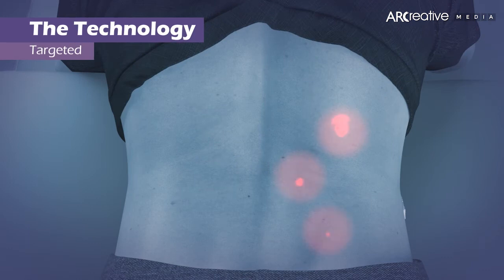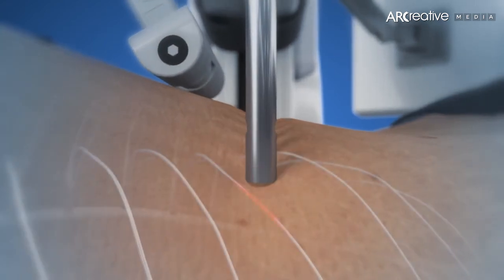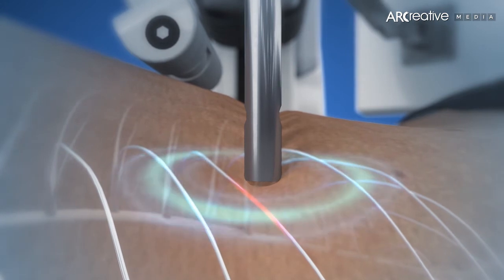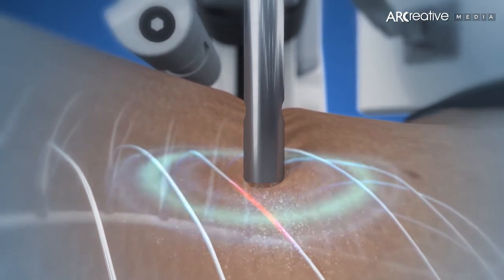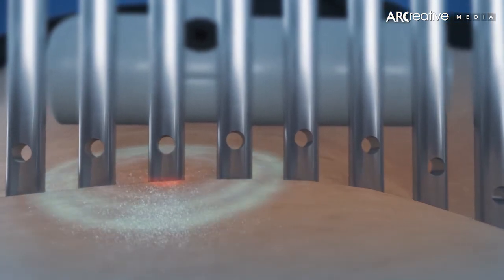Appropriate points are then targeted for treatment. Instantaneously, a series of localized, dense electrical pulses are delivered to the targeted points, accelerating the release of our own body's natural painkillers and providing highly effective pain relief.